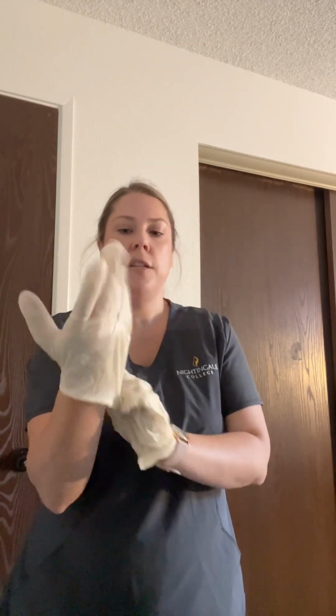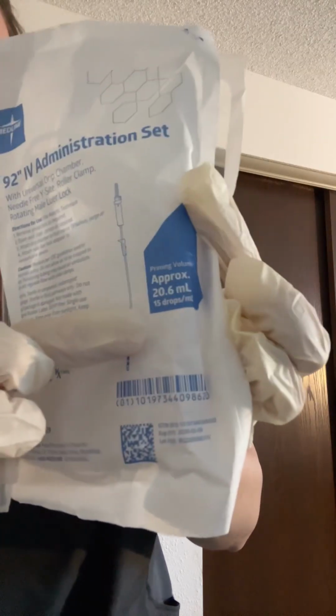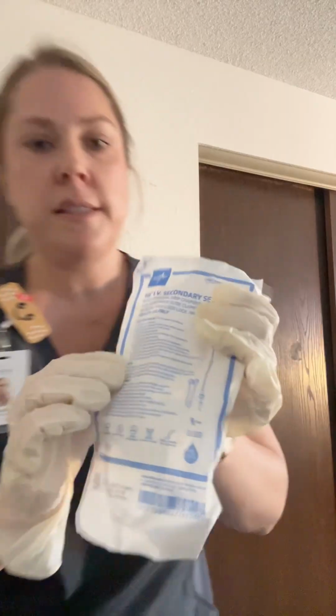Next, I am going to go over the different parts of the primary and secondary tubing. So here we have our primary tubing, which shows 15 drops per mL. Secondary tubing is the same, showing 15 drops per mL.